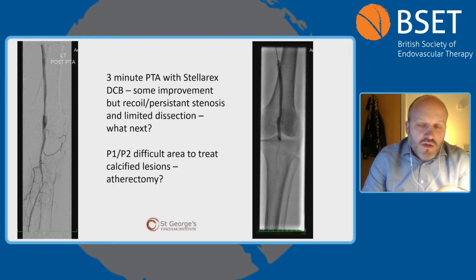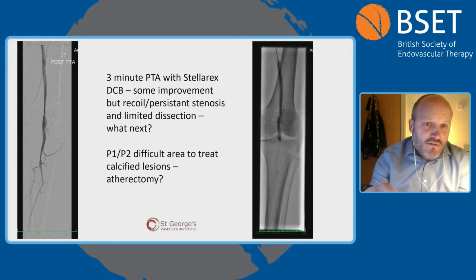Having said that, of course, we're at the beginning of our journey of atherectomy. It's something that we've now done a handful of cases of, and we're learning. And I think we need to have those cases pre-planned. We're not at a stage, unfortunately, in our practice yet where we can just reach for the atherectomy device mid-case.